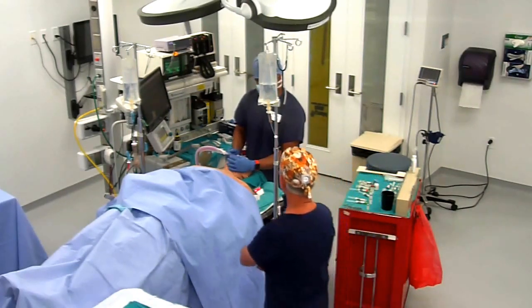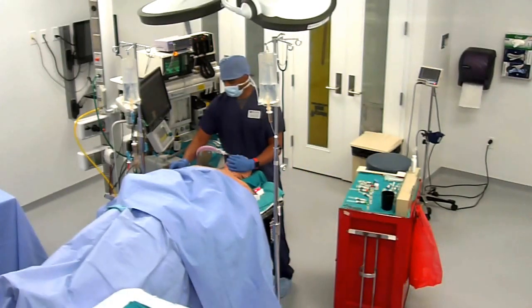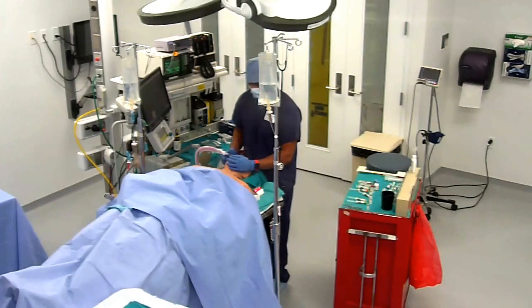How do you know it's reversed? With the wake up, that's the ulnar nerve. Induction is the facial nerve, and I have all 4 twitches on the ulnar nerve. Patient also does a head lift, which would mean 50% of the receptors are occupied, and is actually trying to swallow the tube, and is talking around the tube, and is nodding their head and blinking appropriately. Blink 3 times if you want the tube out. 3 blinks. Lift your head up. Good job. They lifted their head to the chin. All right.